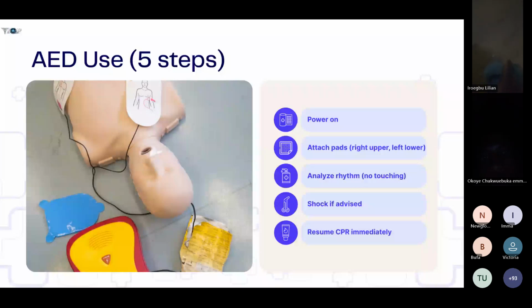Now, immediately after you shock a patient, please do not check for a pulse. Do not check for a pulse. Then you go back to compressions for 2 minutes. Then the AED will reanalyze on its own. Now, moving on to the next slide, special situations.